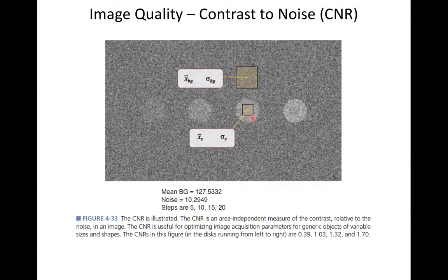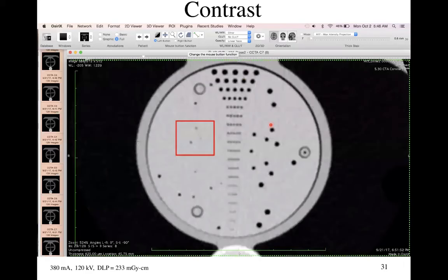And now we have all we need to characterize the contrast to noise. We'll take the signal difference between these two regions, the difference between these two things, and divide by the sigma value. If the sigma is the same for here and here, we can just use one sigma value. So in this case, the mean is, say, 100 and the noise is 10. So basically we get a signal to noise of around 10, although that sure doesn't look like 10, to be perfectly honest.